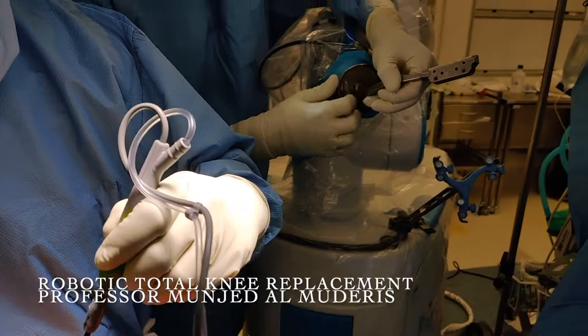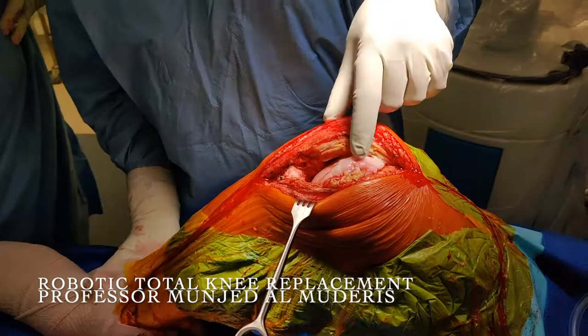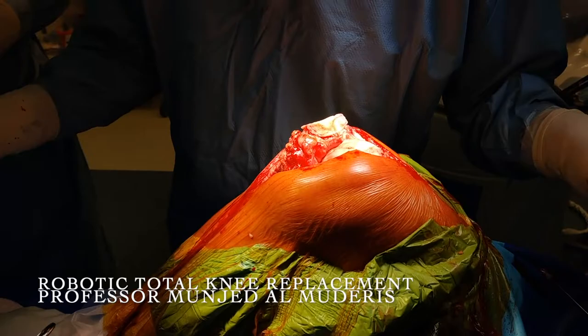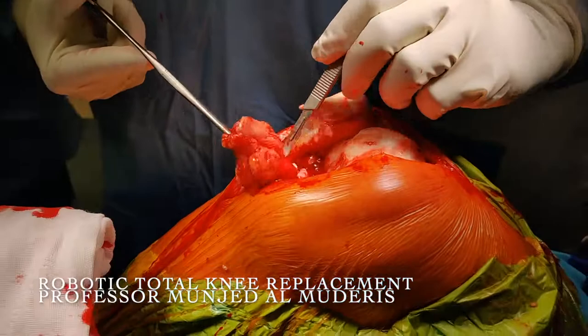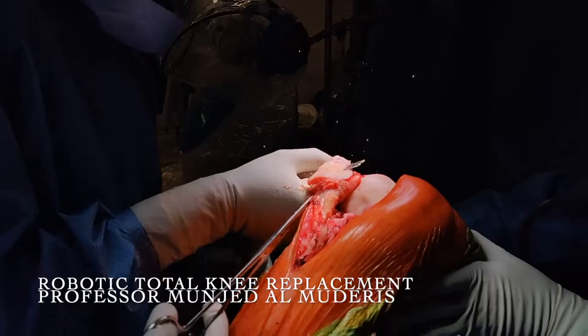I perform a medial parapatellar approach. Once the approach is complete, I reflect the patella laterally and remove the patella fat pad. We then perform the patella resection — I measure the patella height and resect 10mm, leaving 10mm of patella intact.